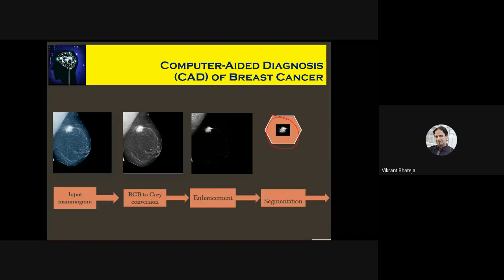So certainly in this image you see that this is a particular tumorous region or a doubtful region which could be suspected as a tumor, and it requires further investigation and analysis by a medical expert. So this is how the CAD approach has worked, and the region of interest has been localized or segregated over here. So the ROI is detected. You see that this is our phase one, that is CAD-E or computer-aided detection.